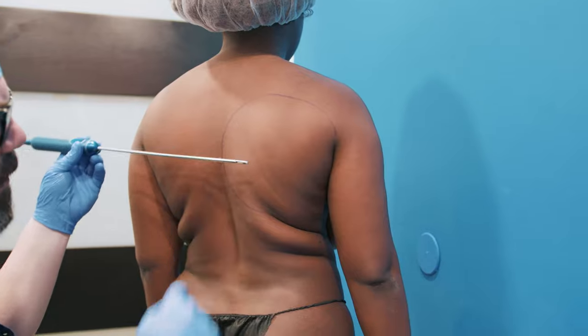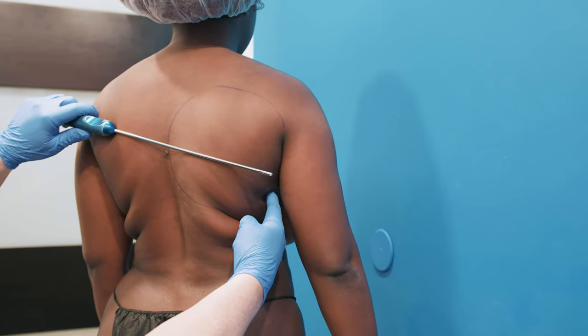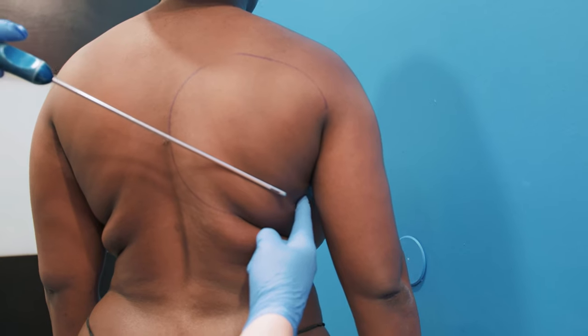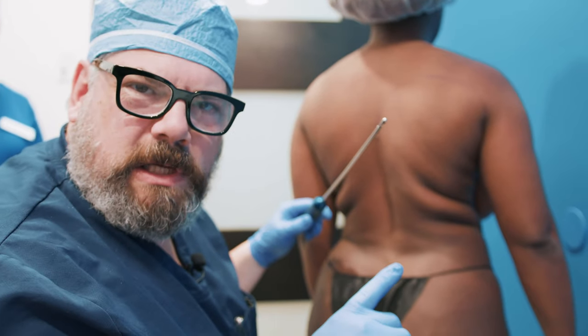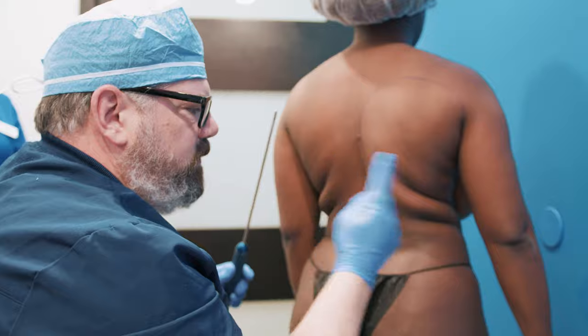You just can't reach this upper area through one incision because of the straight cannula. If I tried to lipo over here using this incision, I would have to go through her lung — and I was taught in plastic surgery school that you should not lipo the lungs. So today we're going to lipo all the upper back down here through the OG lipo.